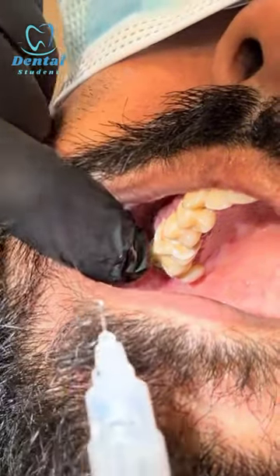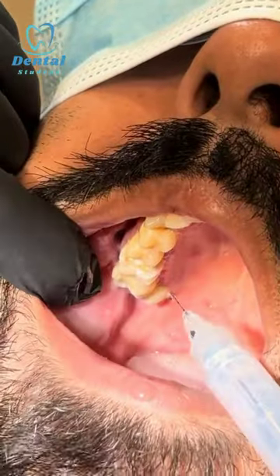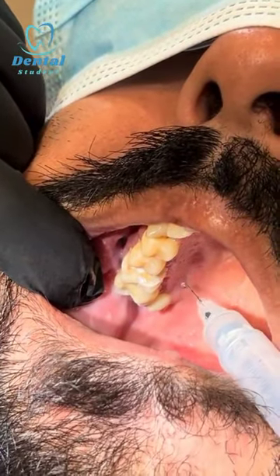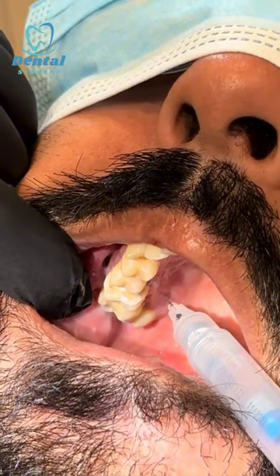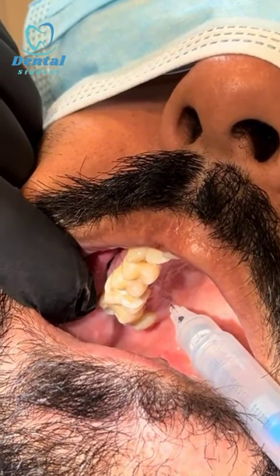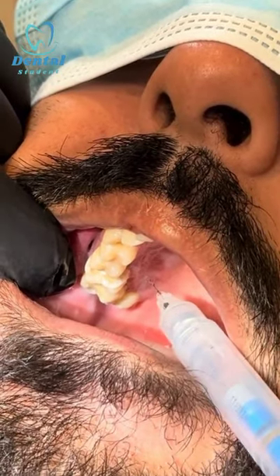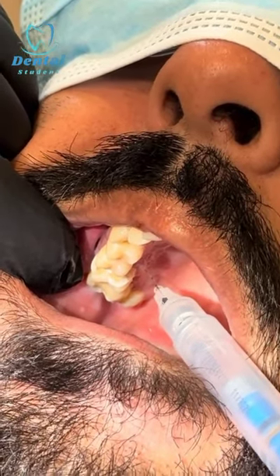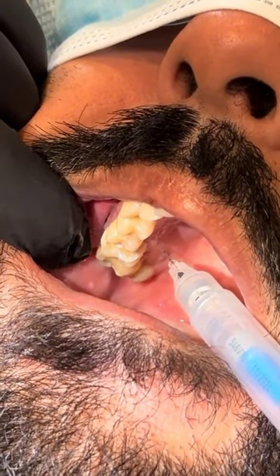And then on the palatal side — open wide — another sharp scratch. You just go right angle to the bone, next to the tooth. Sharp scratch. Well done. Keep breathing through your nose, Dal. So that's for the greater palatine nerve.